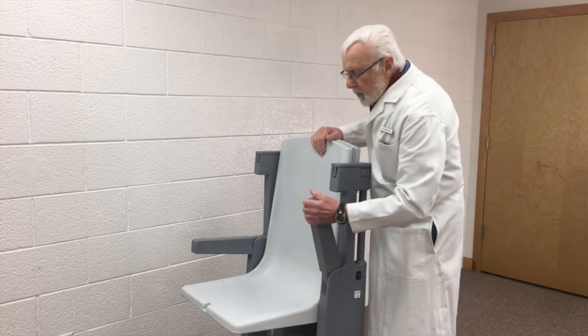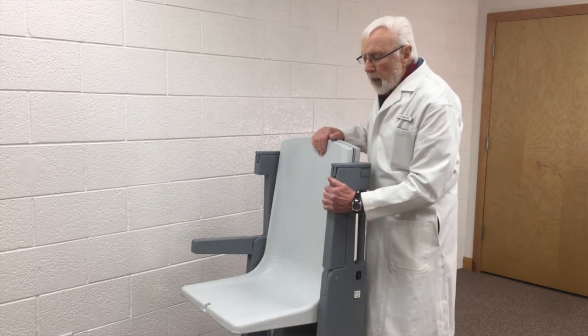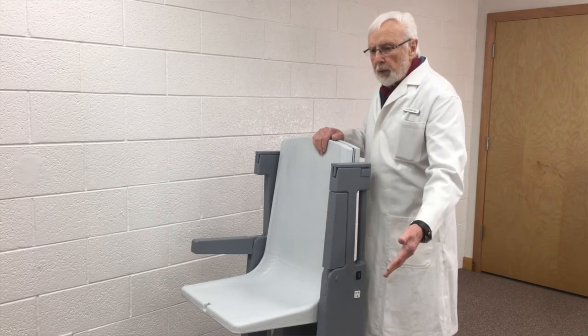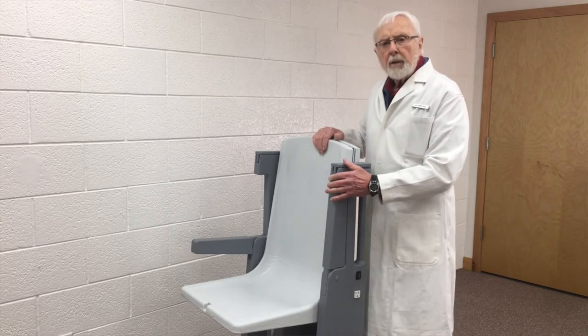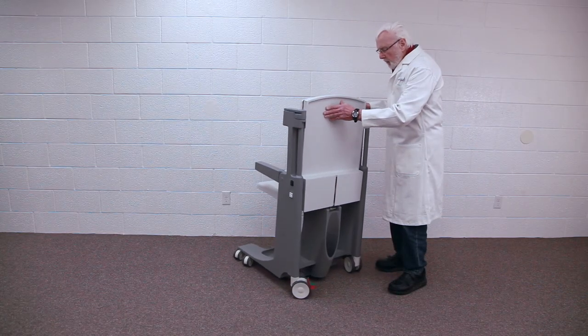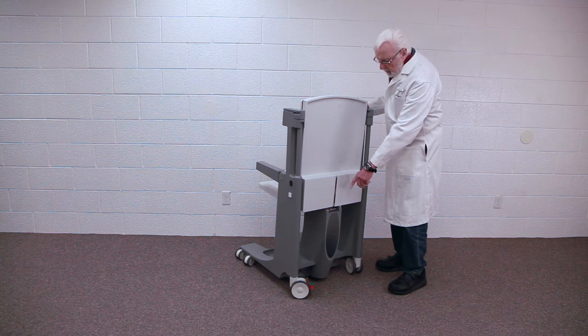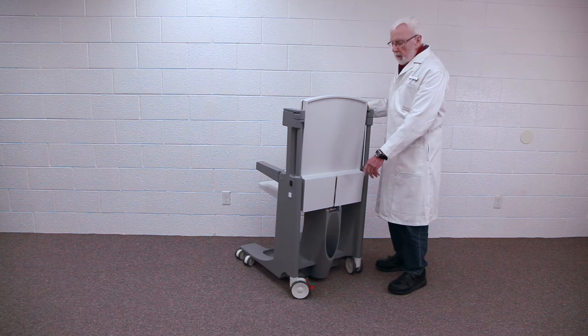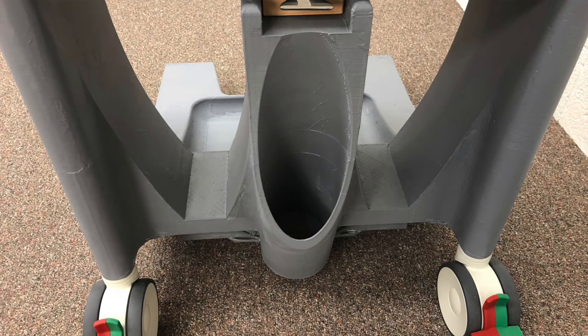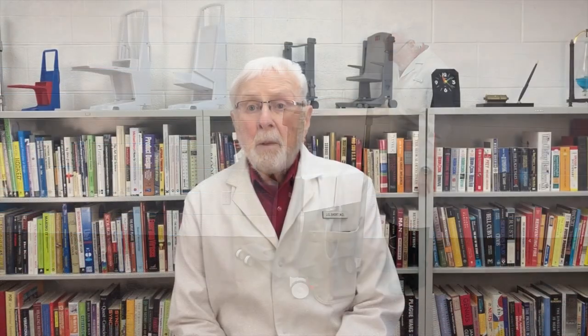You'll also notice that these arms retract, which makes it possible for the patient to transfer to a bed or whatever else they might need to transfer to. Another feature is a receptacle for an oxygen bottle, which will take the largest size of oxygen bottle commonly seen in hospitals. That basically concludes this demonstration.